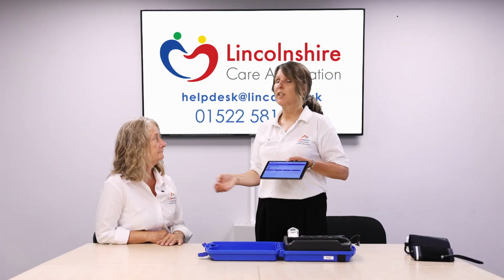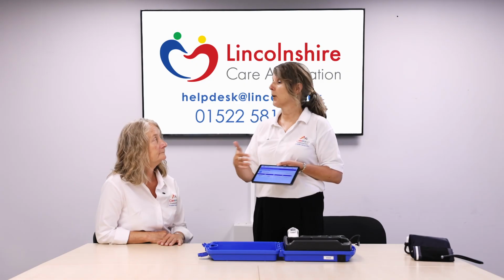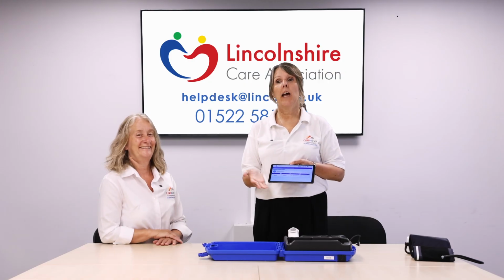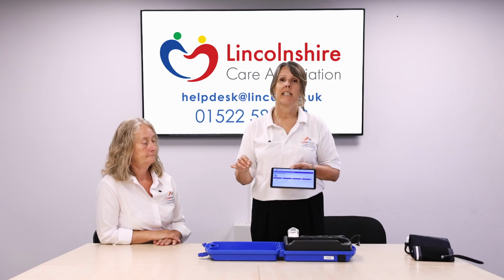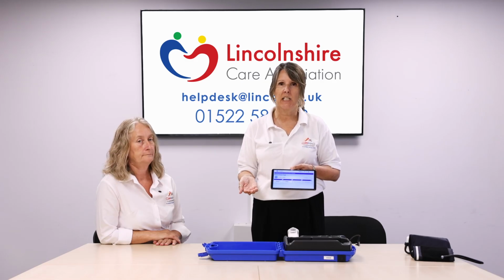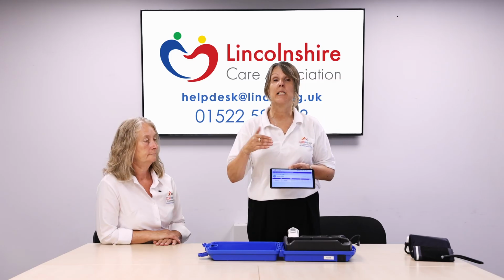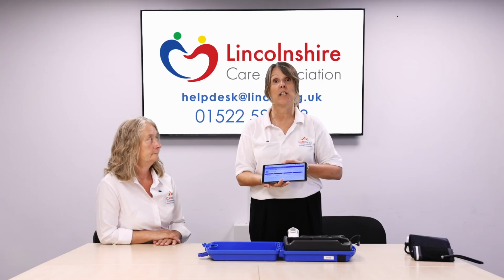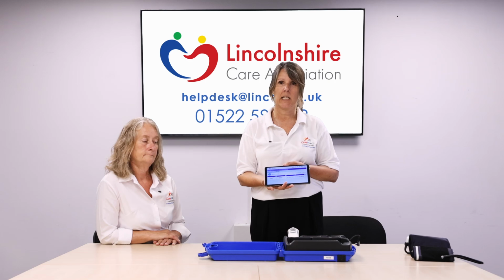So now we've recorded all of Debbie's observations. They're on the device. Just to let you know, you are fine. I'm fit and healthy. But the key element of your remote monitoring, digital monitoring, is to know when to escalate any concerns. So the past readings are all there. There may be some of the readings are set to alert you to the fact that it's either lower or higher than it should be. But the main thing is to know when to escalate the concerns.